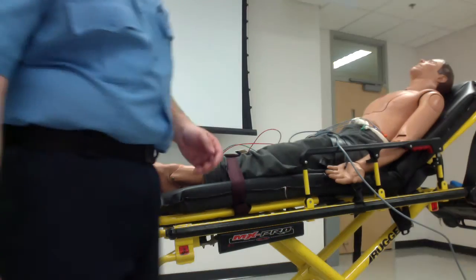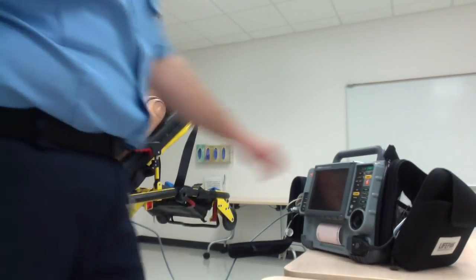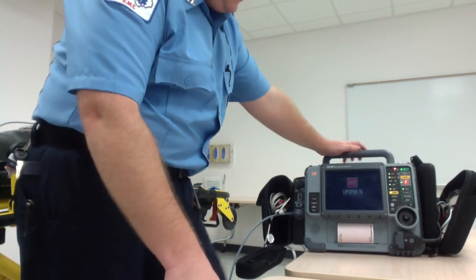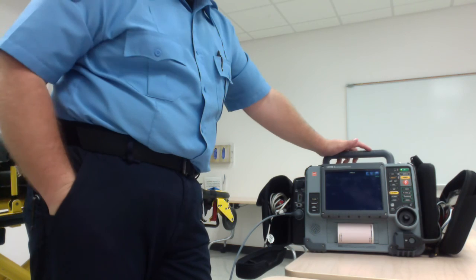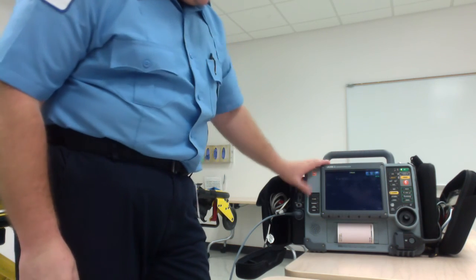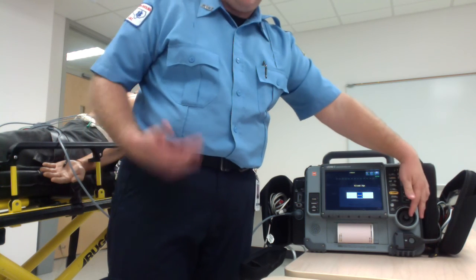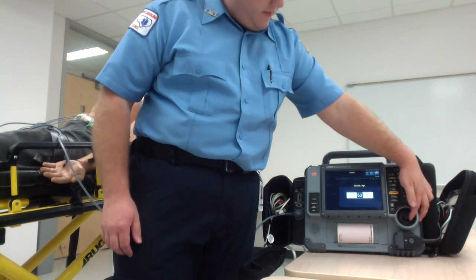Since I don't have a controller for this monitor, we can't actually simulate it. But you will then pull up your monitor. Here we're using the LifePak 15. That's what our local service uses. You will then go to your 12 lead. The first thing it will ask you for is your patient's age. Very simply, put in your age.